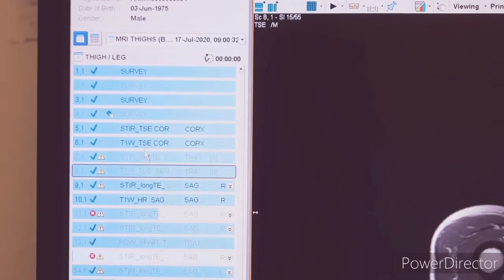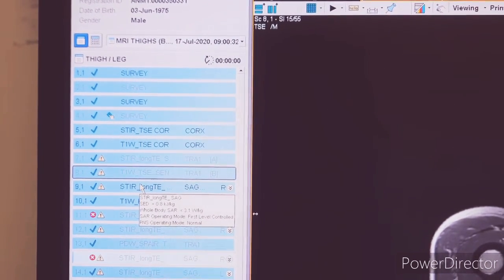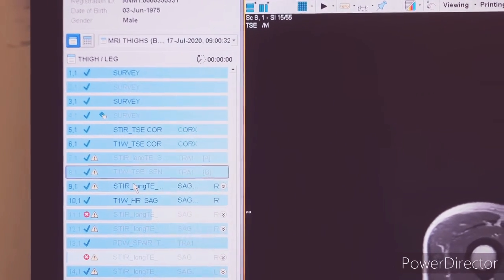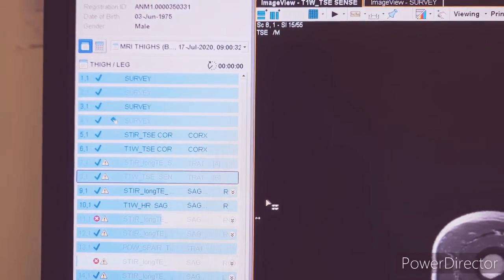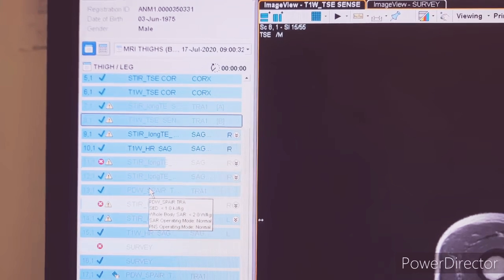These are the sequences we have acquired: three-plane localizer, STIR coronal, T1 coronal, STIR axial, T1 axial, STIR sagittal for a particular thigh. In case the patient has pain in the right thigh, you have to take STIR sagittal for the right thigh only, then T1 sagittal. These are optional sequences: PD-FSE axial.